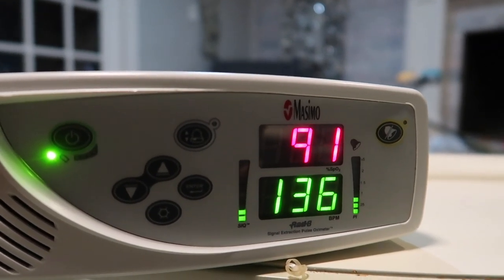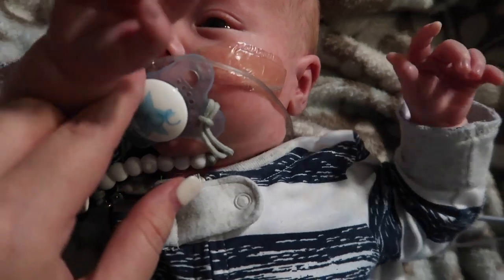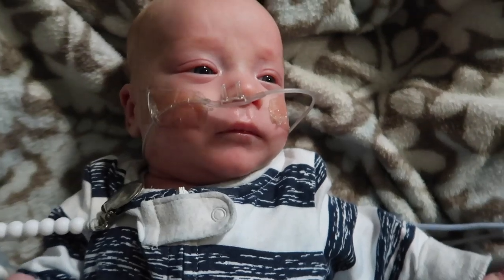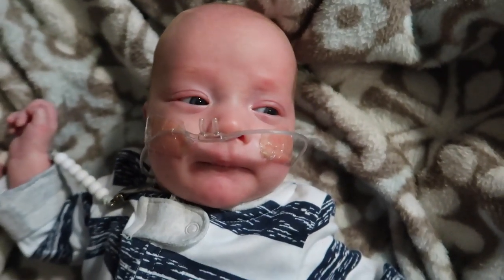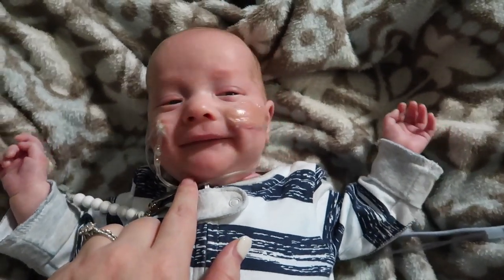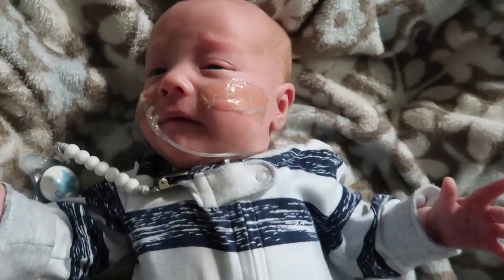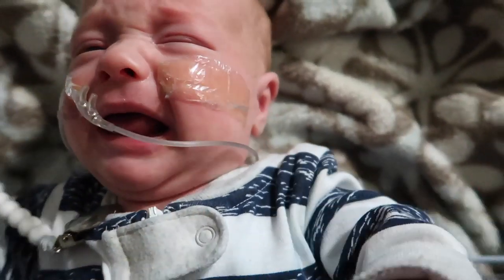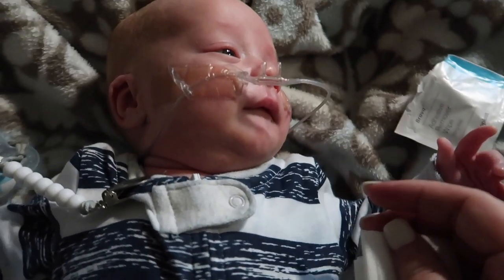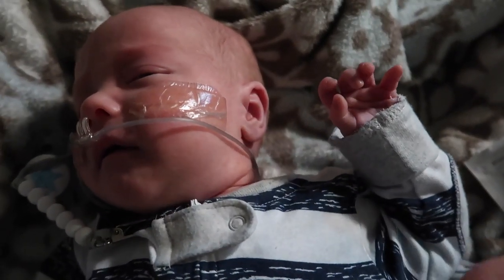So it's time to adjust it. This is currently what my little boy is working with because he took off his nasal cannula and needs it re-taped. We're hoping we don't have to re-tape it — maybe he'll just be good. But he's looking so big and alert now. That is the problem because this little monster does not want that on his face. This tape really makes his face red, so we have to use an adhesive remover wipe to help take it off.